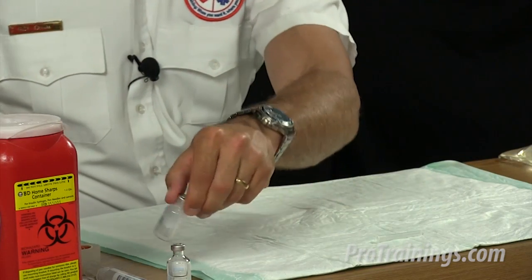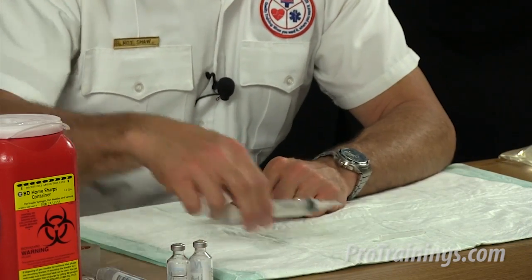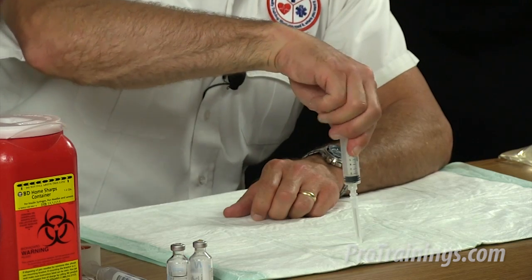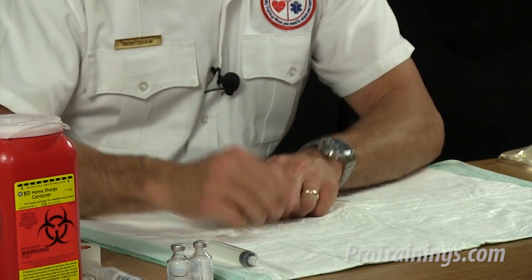After we've withdrawn the appropriate amount of medication, now we probably are going to set this on a tray or get ready for the actual injection in the room. This is where a one-handed needle recapping is going to come in handy, and we can mark that and leave that on the tray safely.